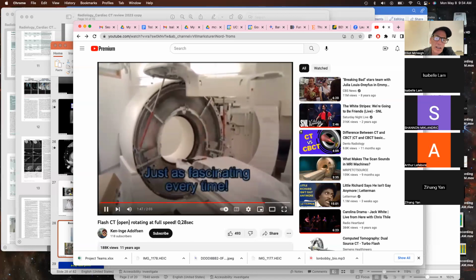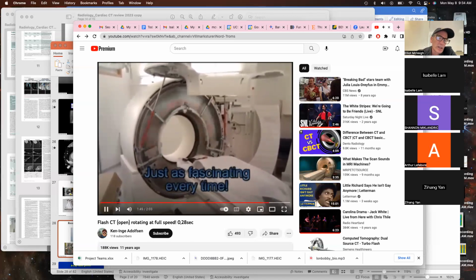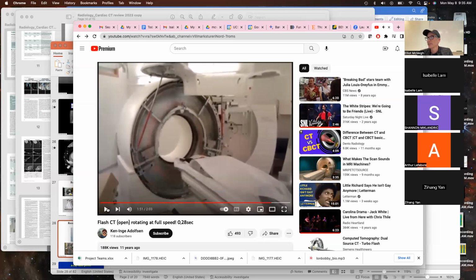this is a lot of mass to be spinning. And so there's a good reason why companies like Siemens and Philips and GE make these machines, right? Because they're large pieces of engineering that require high tolerances. So the barrier to entry to make one of these scanners is fairly high. If you wanted to start your own company, which is your own CT company, one, you would have to license a lot of technology that is just basic to the industry. And 2, you have to have a manufacturing capability to make stuff like this.